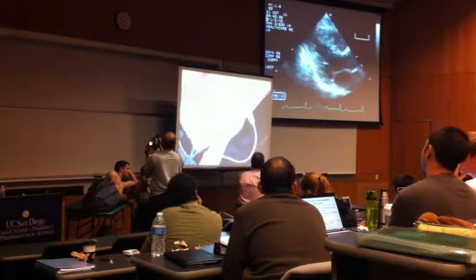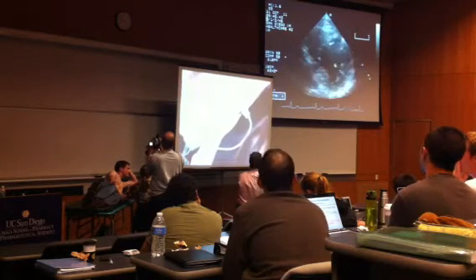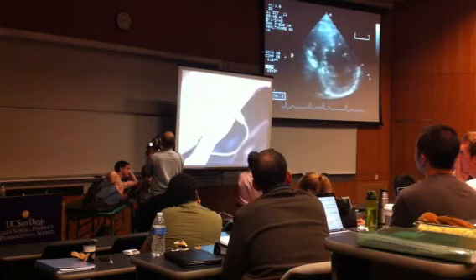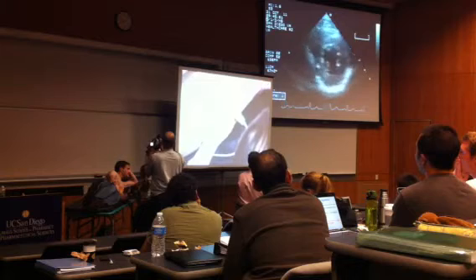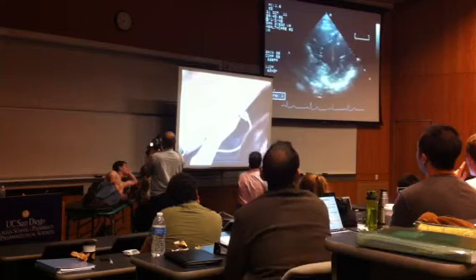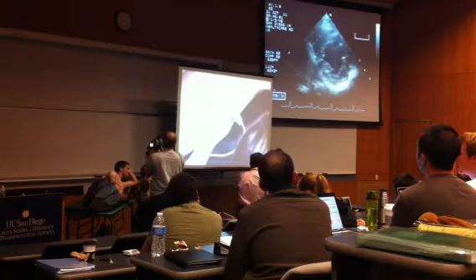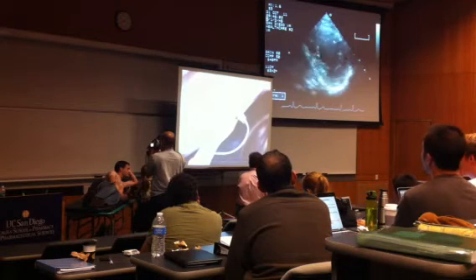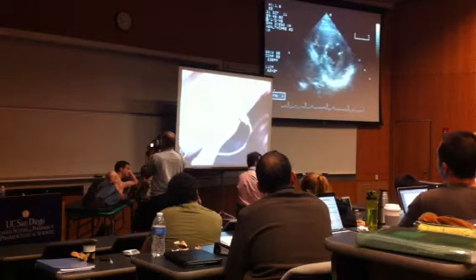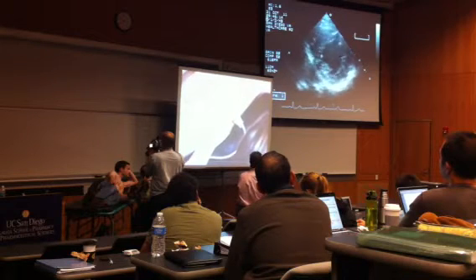Why don't we just go to a short axis here. Again, here we're seeing the left ventricle with the right ventricle, which you can appreciate anatomically is more anterior and almost wraps around the left ventricle. Again, papillary muscles down below. We can see nice contraction and relaxation of that ventricular chamber. If a patient had, for instance, a myocardial infarction and it killed a piece of their heart muscle, if we only took one little slice of the muscle, it might look completely normal. And that's why we need to look in lots of different views to appreciate what's going on.